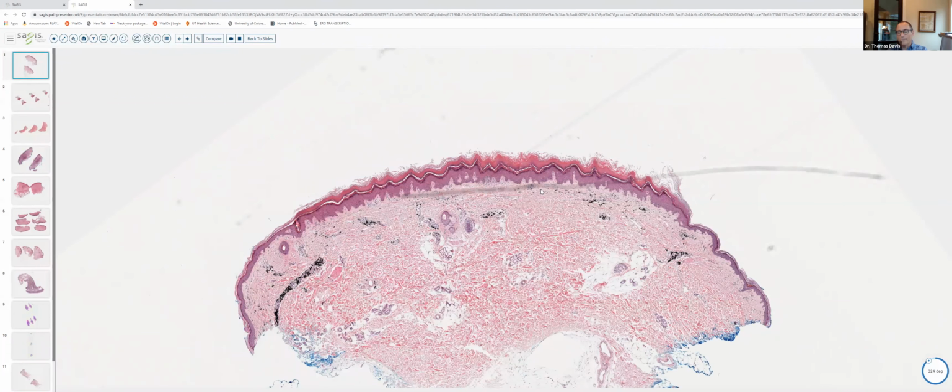And we kind of see that in all of the pieces here. And we've kind of got these fascicles of thickened collagen bundles forming whorls associated with an increased number of fibroblasts and absent adnexae and dilated vessels.